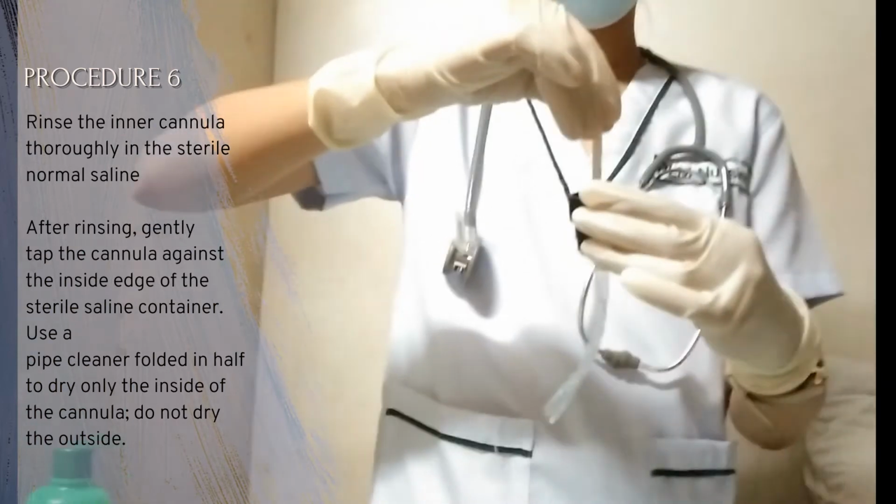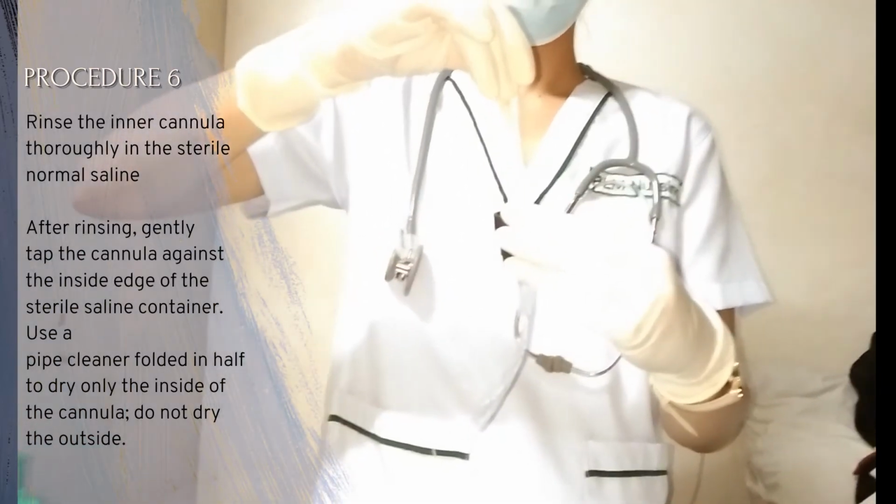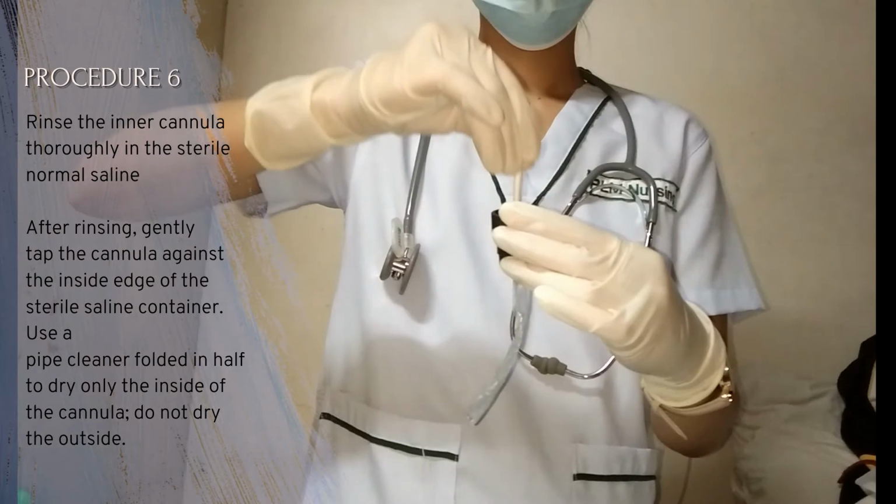After rinsing, gently tap the cannula against the inside edge of the sterile saline container. Use a pipe cleaner, folded in half, to dry only the inside of the cannula. Do not dry the outside. This removes excess liquid from the cannula and prevents possible aspiration by the client, while leaving a film of moisture on the outer surface to lubricate the cannula for reinsertion.